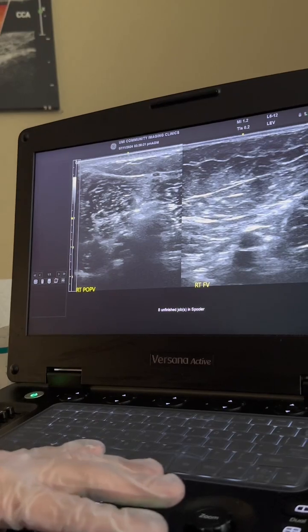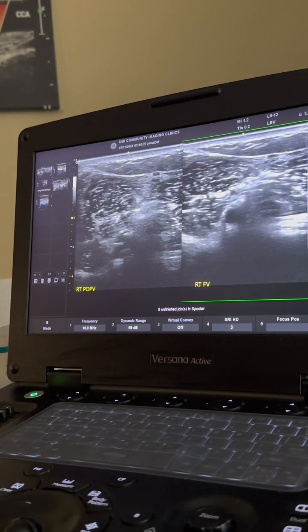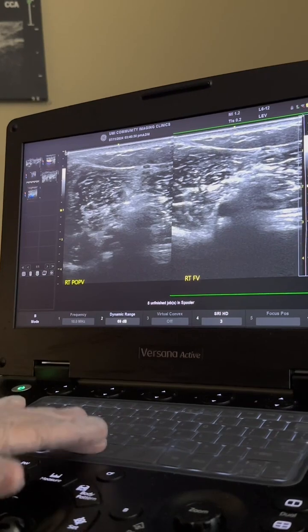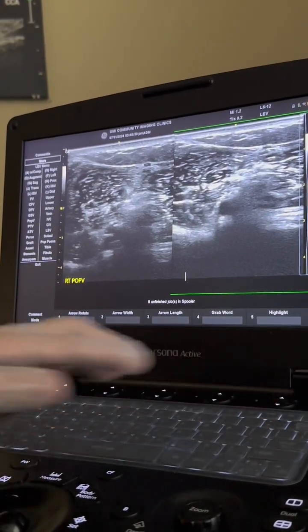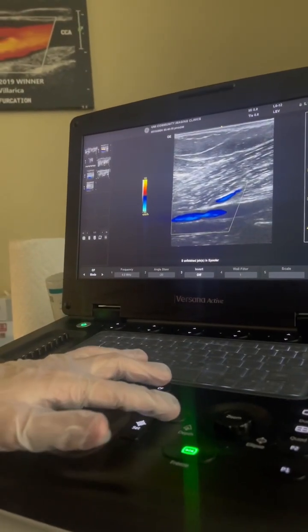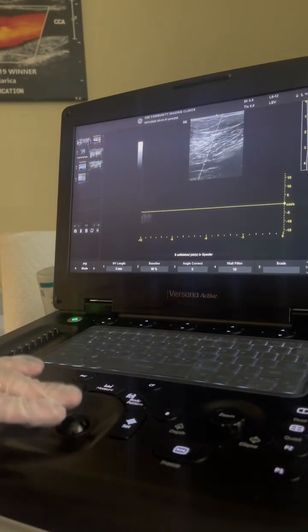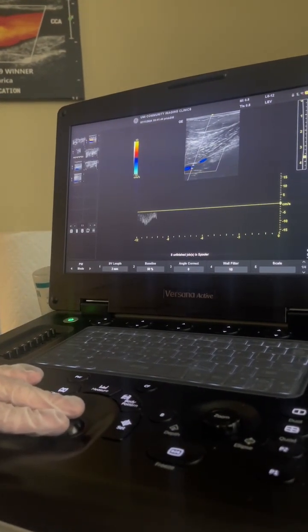Next, we're going to go to the popliteal vein, where we're going to get a dual image of non-compressed and compressed of the popliteal vein. It is also very important to change your annotation as well. You're then going to turn the probe to sagittal position onto the popliteal vein, and make sure to get color as well as pulse wave Doppler.